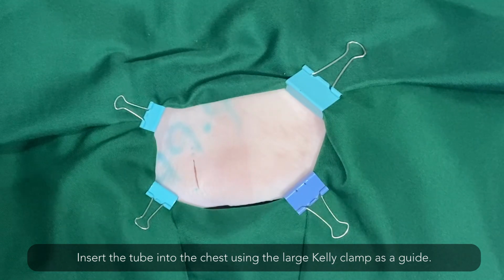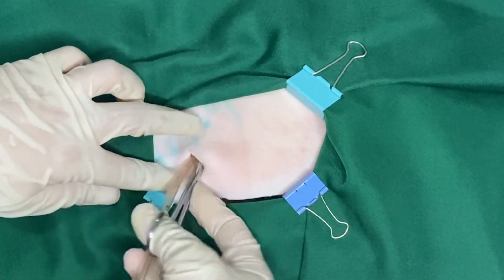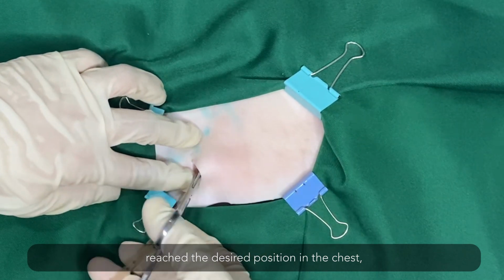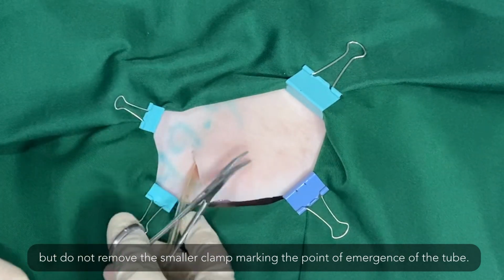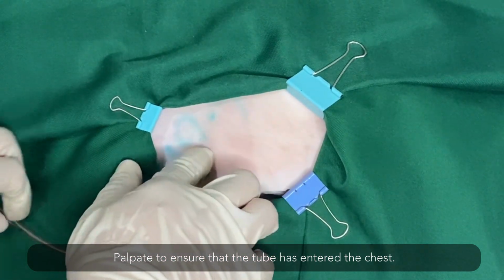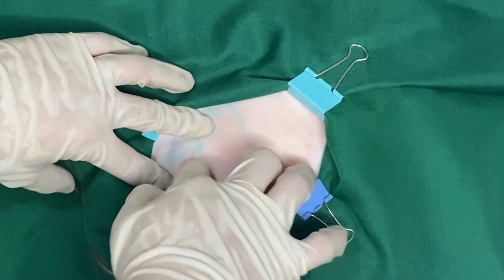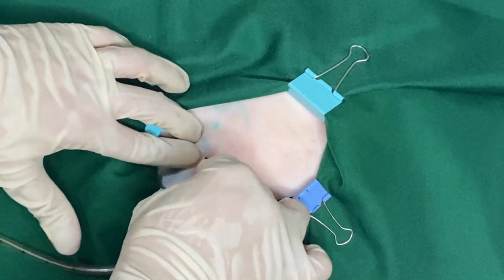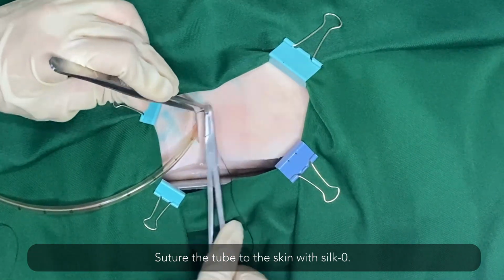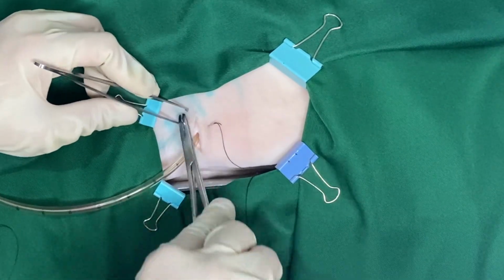Insert the tube into the chest using the large Kelly clamp as guide. Remove the large Kelly clamp as soon as the tube reaches the desired position in the chest, but do not remove the smaller clamp marking the point of emergence of the tube. Palpate to ensure that the tube has entered the chest. Suture the tube to the skin with silk O. Only after these sutures are placed may the smaller clamp on the tube be removed.